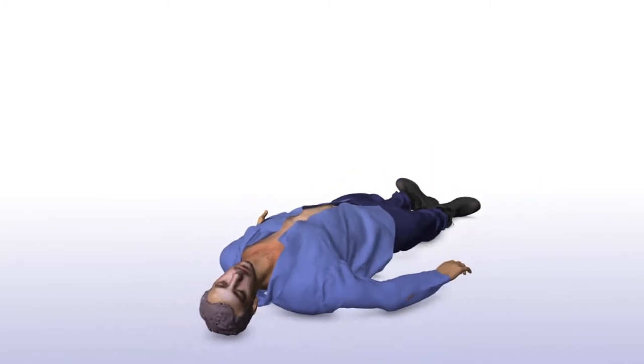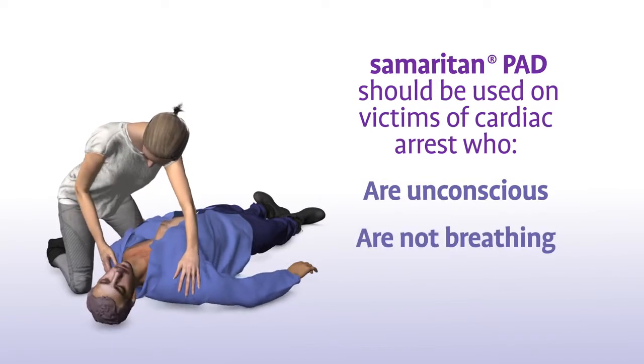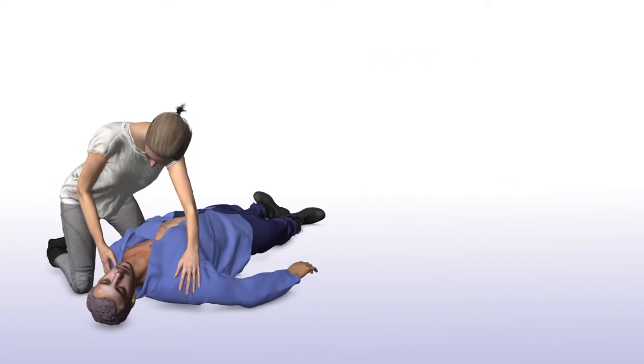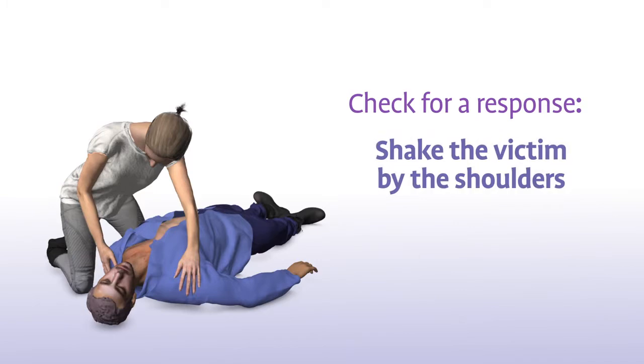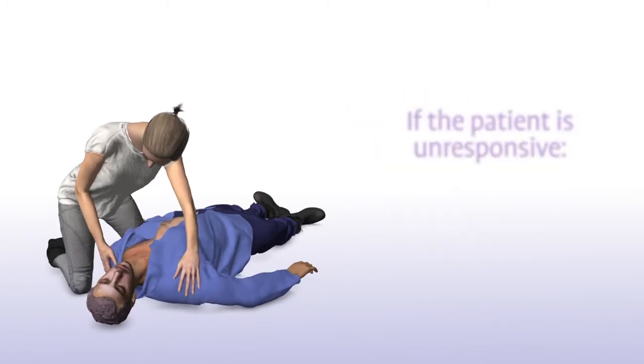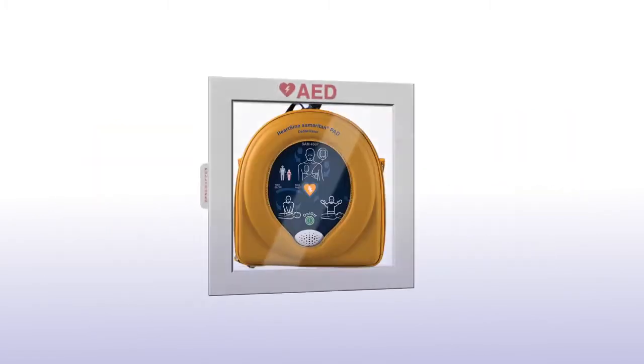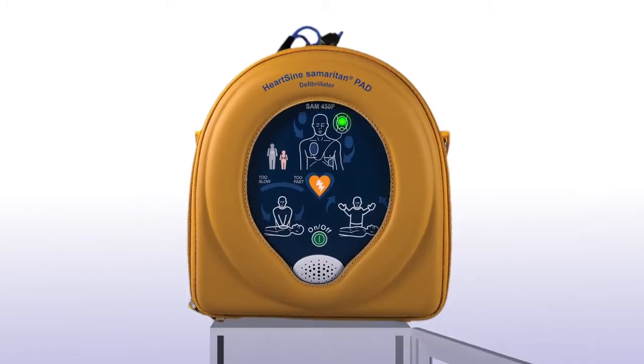The Samaritan PAD should be used on victims of sudden cardiac arrest who are unconscious, not breathing, and have no pulse. Check for a response by shaking the victim by the shoulders and talking loudly to the victim. If the patient is unresponsive, immediately call for medical assistance and get the Samaritan PAD as quickly as possible.